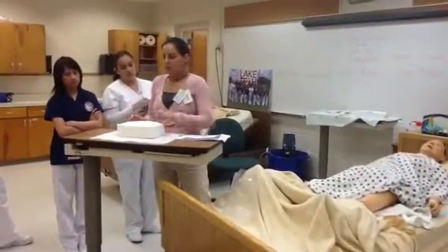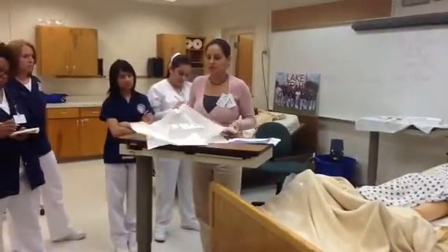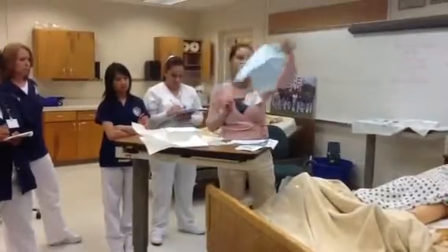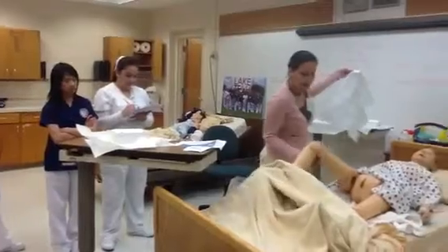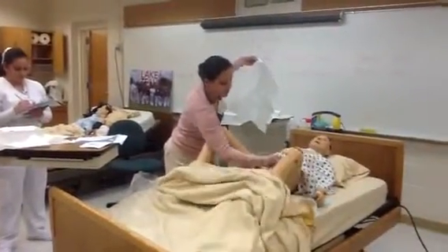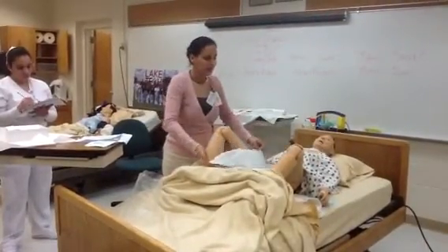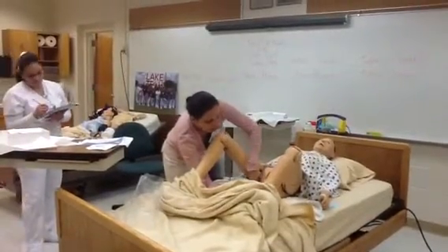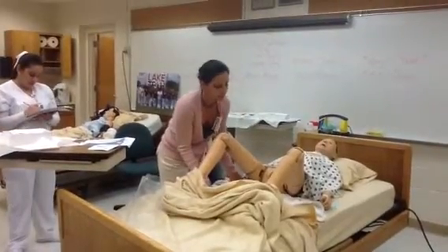Every time that we open up a sterile field, first is away from us, and then is towards us. We take off our gloves. Take this out. And my dear, I'm going to have you go ahead and get into a position where I can lay this down. This is going to be an extension of the sterile field. I have to be very careful with it. And I'll know that my 1-inch margins are not good, not sterile. Okay?